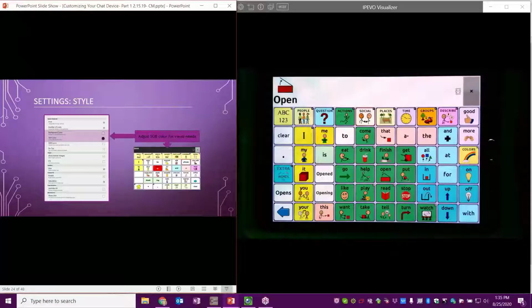So he would communicate on the device, and then the team was also using the device to talk to him using those symbols so that he could understand what they were saying because their communication and hearing was limited. I do caution teams who are using the button icons to try and improve literacy skills. What the research tells us is that that is not true, right? Icons with sight words does not help support literacy. In fact, it's distracting. So if that's the only reason that you're using the icons in the speech display bar, I would recommend probably not using it for that reason.